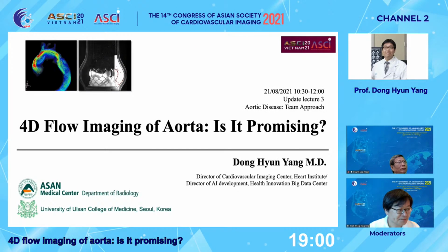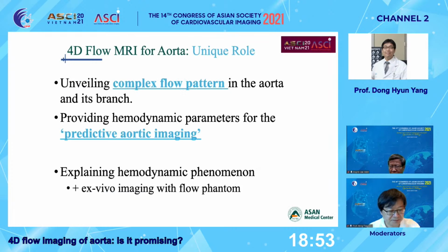Now, the question given in my presentation is, is 4D flow MRI promising for aorta imaging? My answer is yes. I think 4D flow MRI has a unique role in aortic imaging. The first is that 4D flow MRI could unveil complex flow patterns in the aorta and each branch.